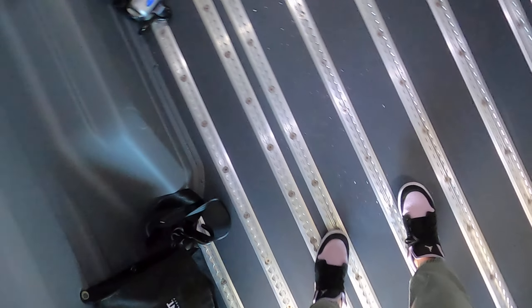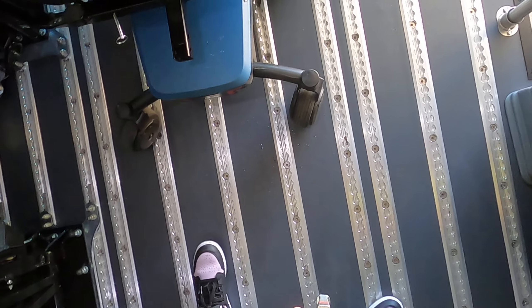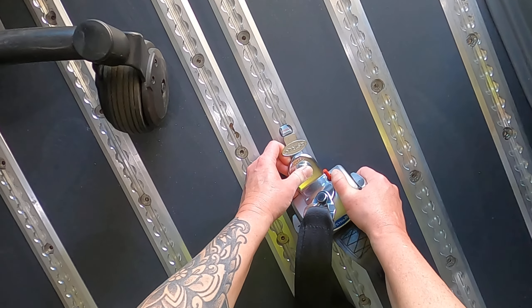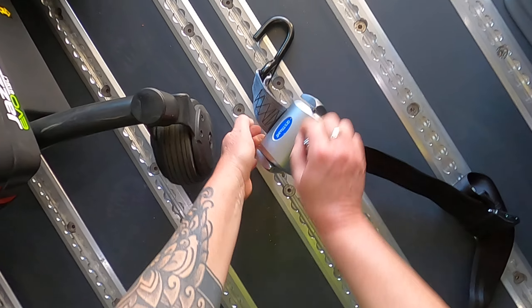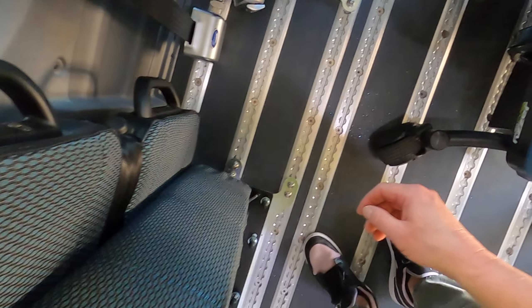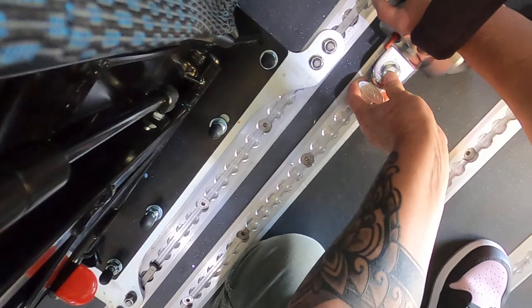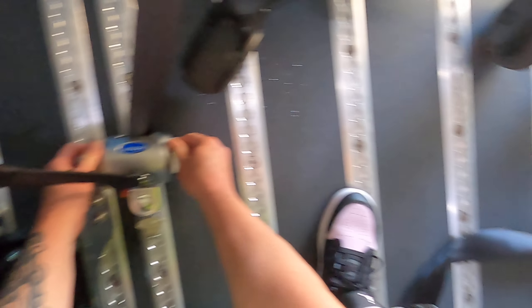Now for the back securements. The one on the right needs to have the seat belt buckle. Since the front securements were narrow, the back will be wide. Remember, this is different than what we usually do. I'm going to attach the hook to a solid frame member using a direct path. It's a little more than a 45-degree angle because I need to fit two other chairs in here. If you were only picking up two guests, you could move the retractor back and create a better angle. The left retractor needs to have the other part of the seat belt — put it in the floor track, push the red button to release tension, hook it to a solid frame member, and tighten it up.